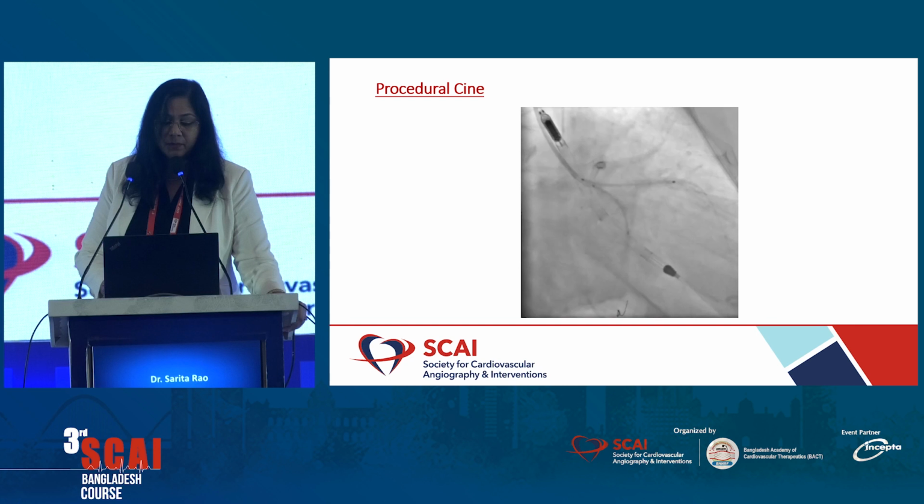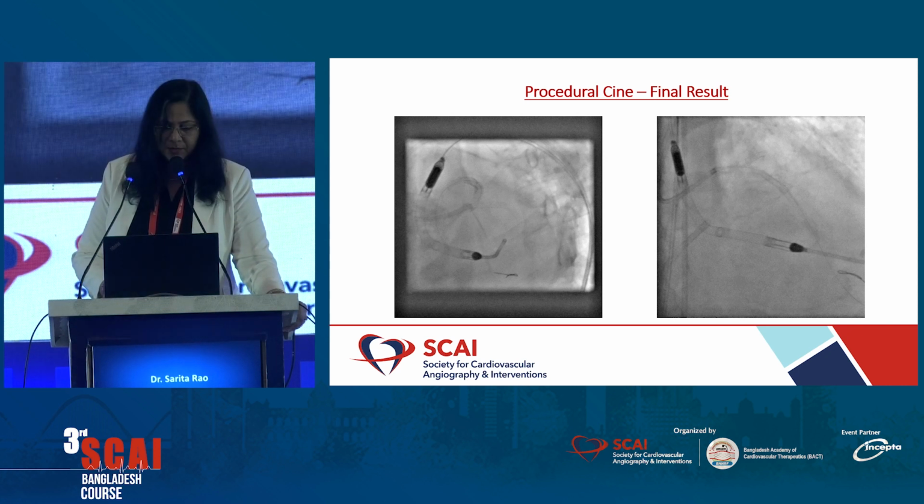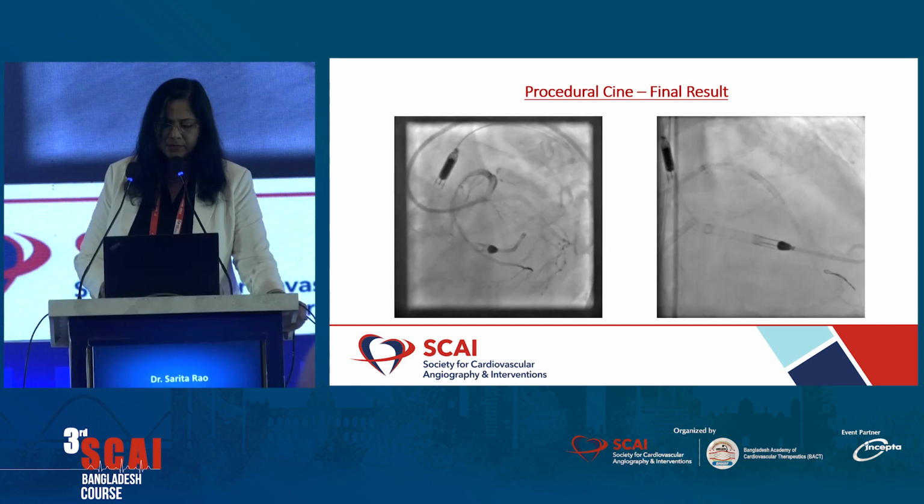And we did a mini crush for this patient. Incidentally, this was done live at Sky Phoenix. Did a mini crush for him, and this was the final result.